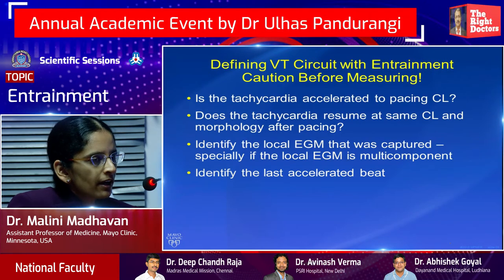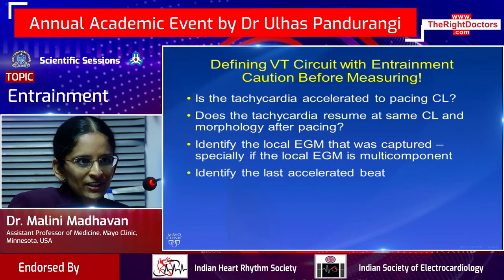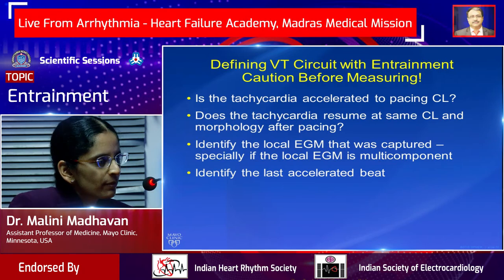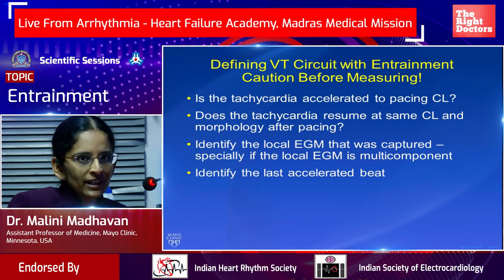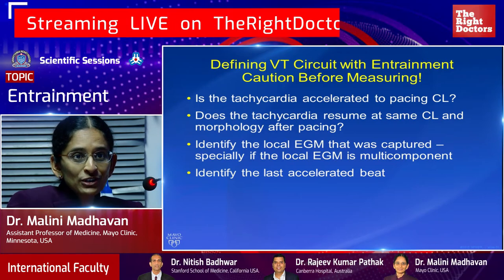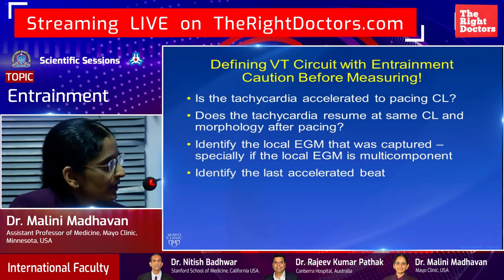Again, before you start measuring some of these things, a few words of caution, because we often get excited by entrainment maneuvers and we just start measuring PPI. But before you do anything, you really want to make sure that the tachycardia got accelerated. Sometimes when you pace, it doesn't capture. It looks like good fusion on your ECG, but what you're really doing is nothing to the tachycardia. So you want to make sure you accelerated it.